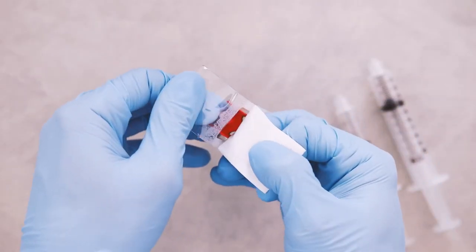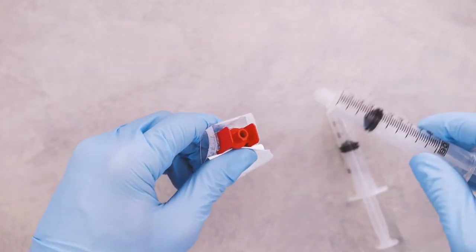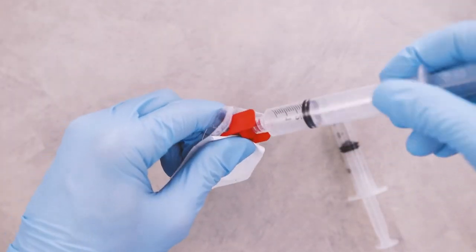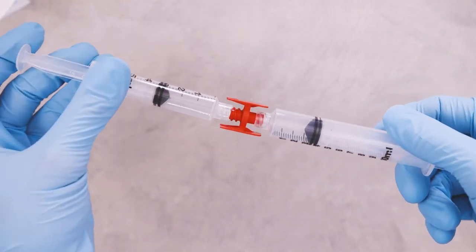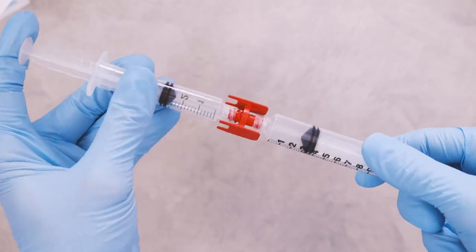To use, simply peel open the package and insert the compatible Lure connector while rotating clockwise and pushing down. Repeat the same motion to connect the subsequent compatible device to the remaining free end of the assembly.